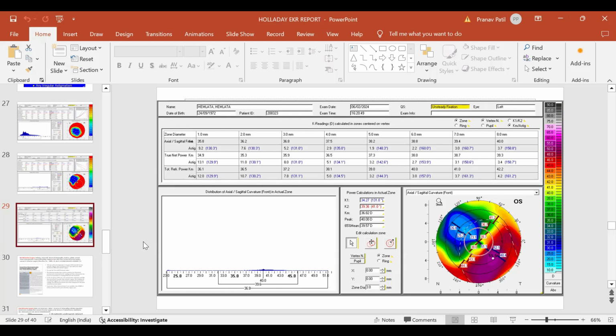So you're right. That's how we learn, and where to use which one. That's the important thing. We can open the Pentacams, because they had already been done for those patients along with the EKR. So exactly, we probably can do a retrospective study, and you can go back and see 10, 15, 20 patients and see what was working better. It'll be useful because the results were quite okay, but obviously for better results, this one's better. But since we were getting okay results with them also, we have to see the accuracy of both in that case, I feel.